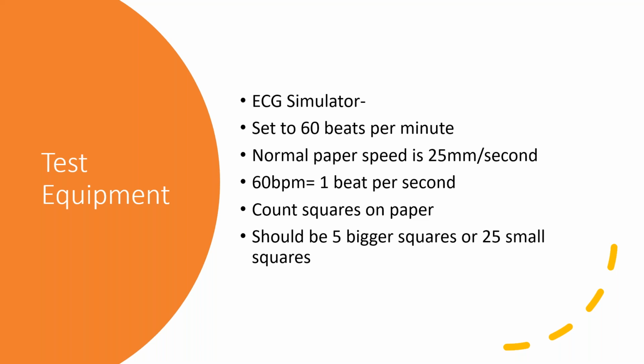The little strip recorder is just a tool to see if more is needed. Like they order an EKG, right? The cart comes into the room, and someone from cardiology will set up the patient, right arm, left leg, right leg, V1 through 6, and do that 12 lead ECG. But when you're checking those, it needs to be right on the money: 5 squares between each heartbeat at 60 beats per minute.